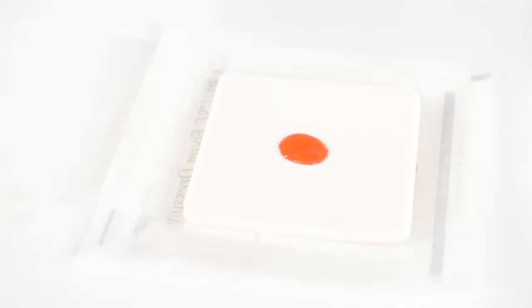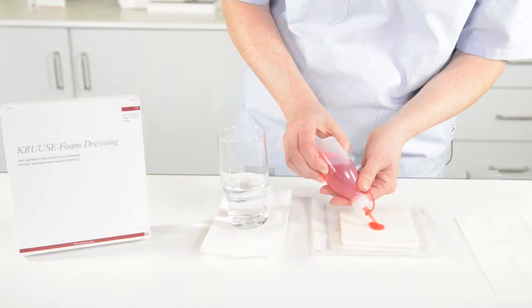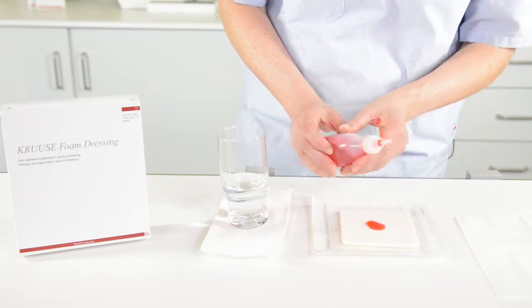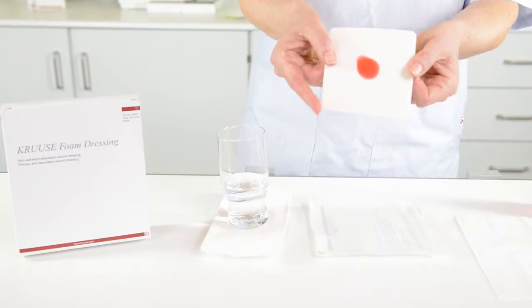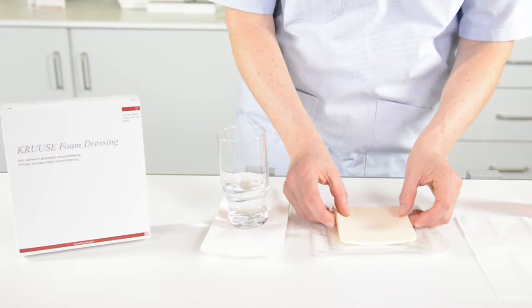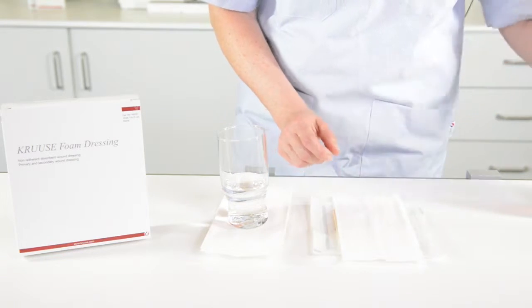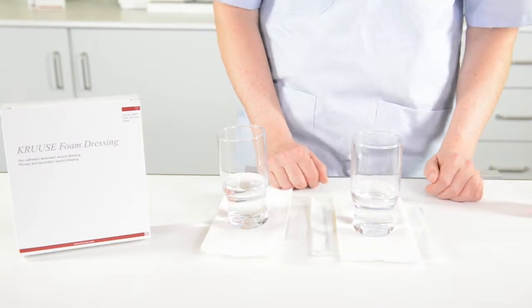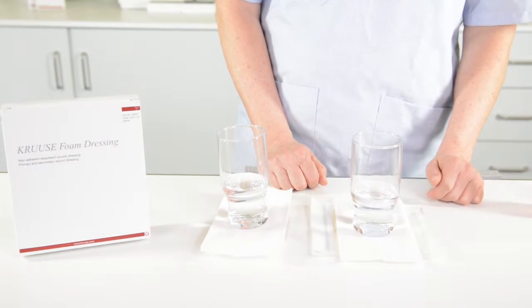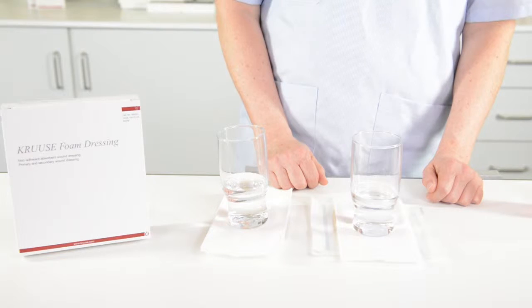You have to break the surface like this to simulate a wound. Already now you can see how it starts to expand. I will turn it around just on the packaging, and again I will put on the paper and try to simulate compression. Now you can leave it on for as long as you like and take a peek within 10 to 15 minutes, whatever time it takes.